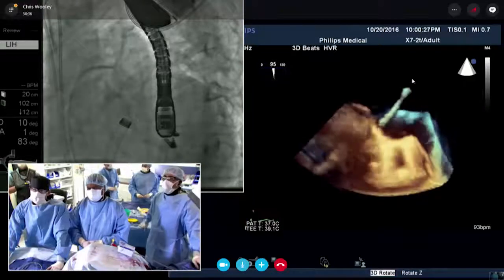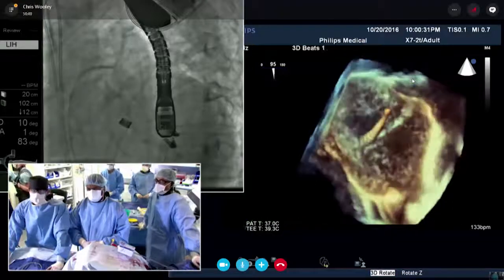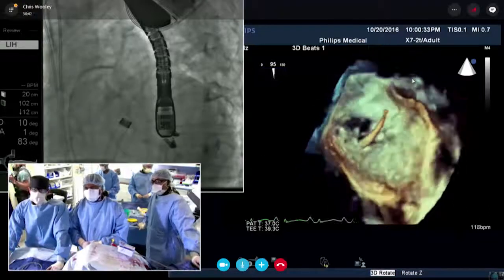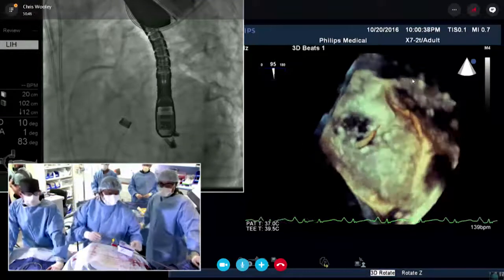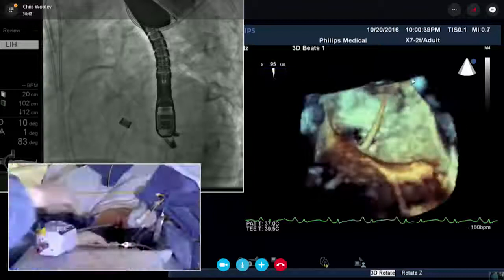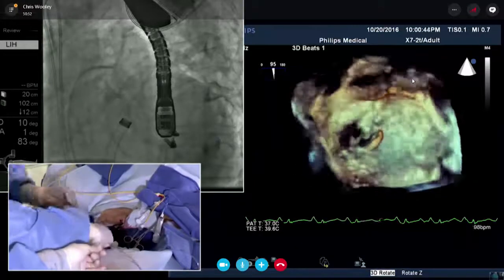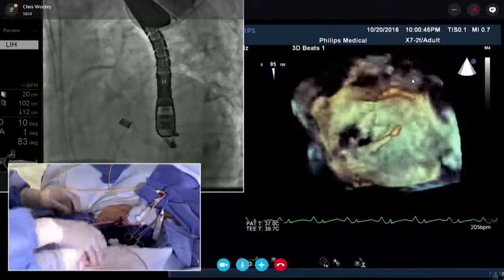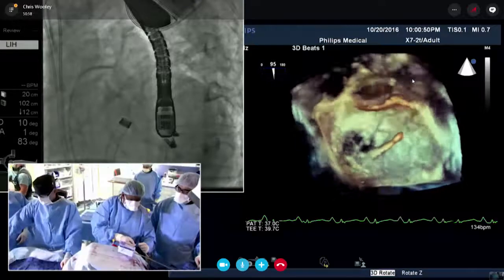Can you see the short axis again, or 3D? Oh, you mean the 3D? Oh, okay. This is now? Yeah. That's just a pigtail across. I think I'm happy to just pull the wire in. And I really don't think we're going to close this hole. Just keep. No, this is fine, single wire. But we do want to show you how we're going to close the hole.